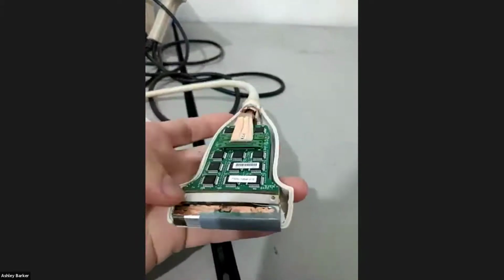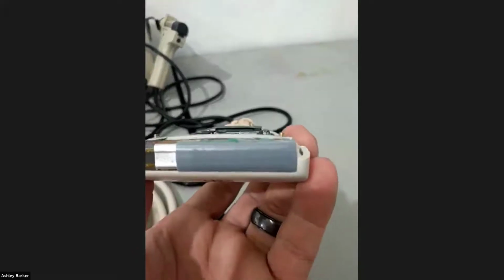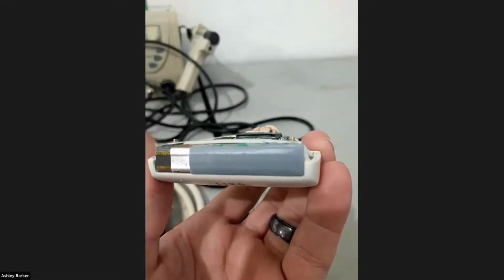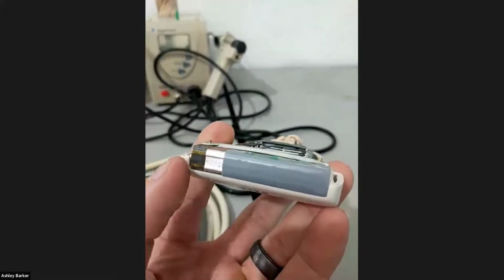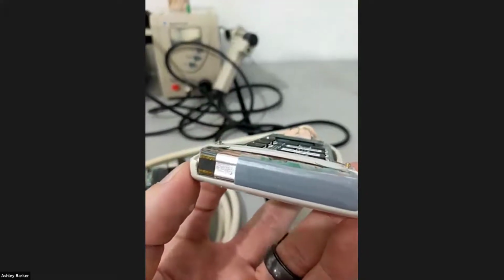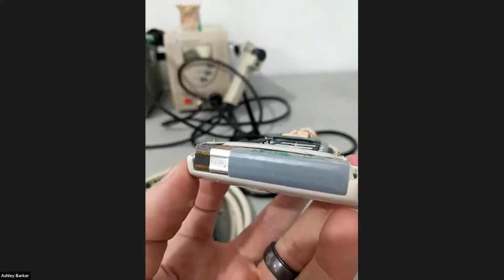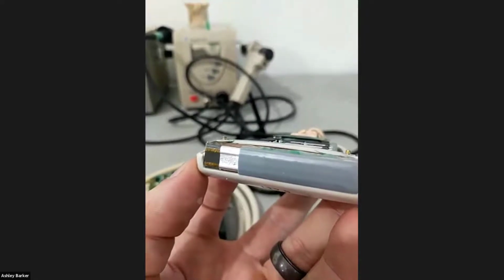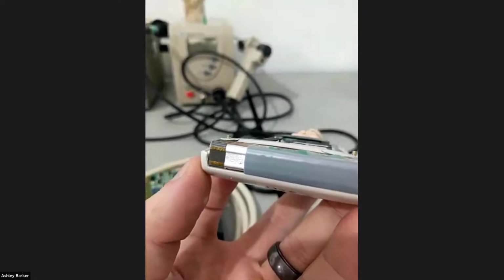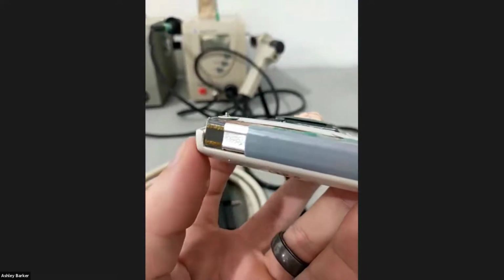If we look again at this, what we've done on the end here is you can see that gray surface, which is the lens that you normally see, the silicon lens. Then there's that silver section off to the side. That's the matching layer. We've just cut the gray section off and you can see that matching layer. It matches the acoustic impedance of the crystals with the lens material. And then finally, that little tiny section up here is the actual array. So we've pulled that matching layer off.